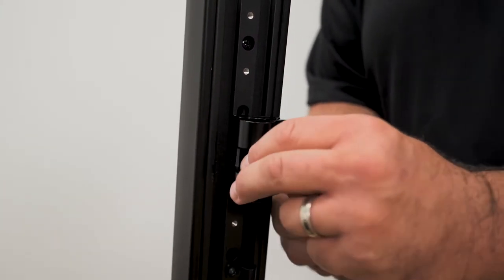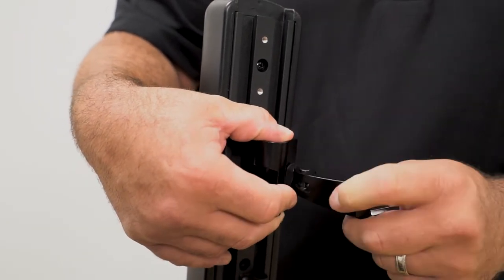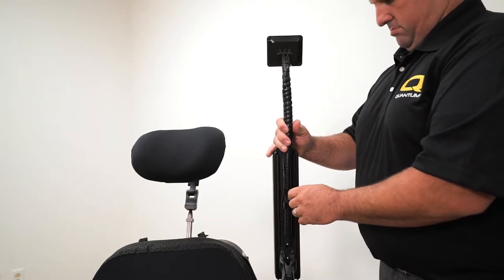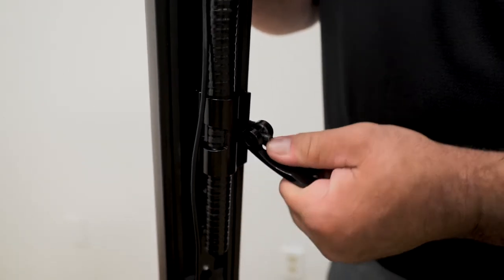Next, insert the receiver tube to the bracket and secure by tightening the thumb screw. Then insert the gooseneck into the receiver on the armrest and tighten the clamp by turning the levers clockwise.